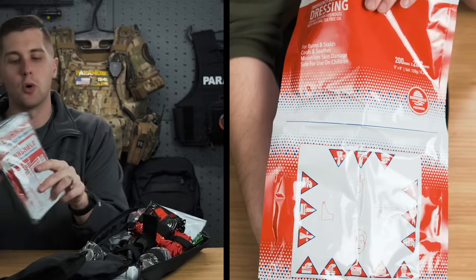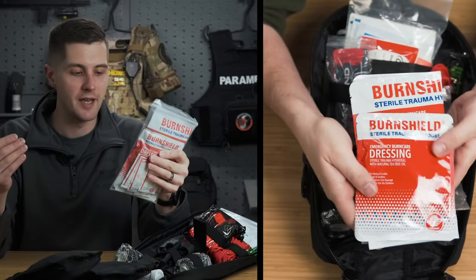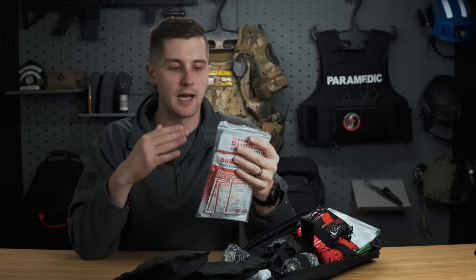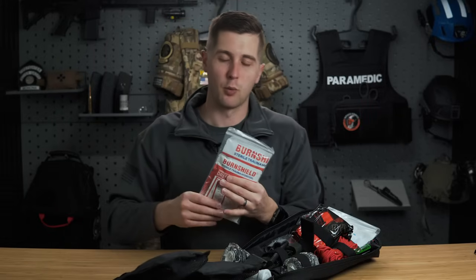Now, I don't know a whole lot. This is hydrogel. I'll tell you, our protocols on the helicopter and on the ambulance for burns is we rinse it, we cool it, we get it down to where the burning process is no longer happening, and we wrap it with a dry sterile dressing. You get a lot of other stuff on it. It just makes one more step for the burn center when they finally get there.